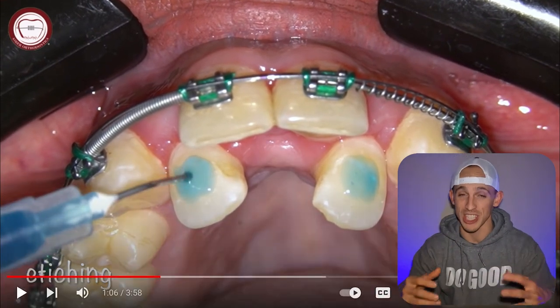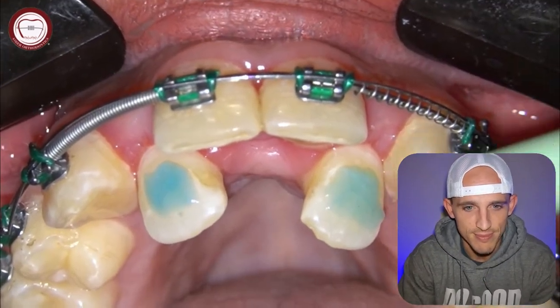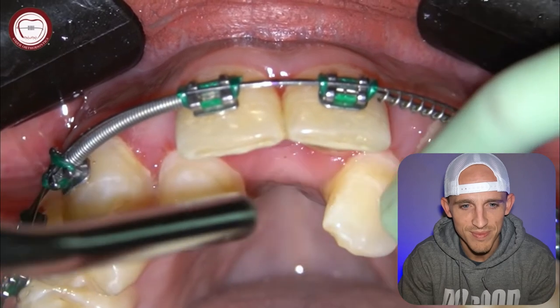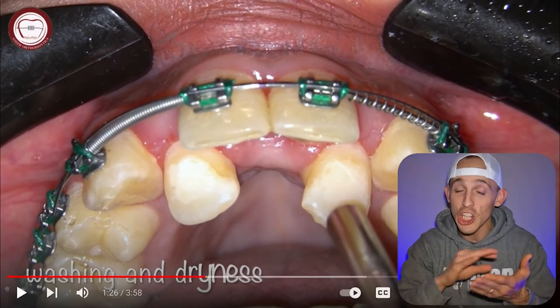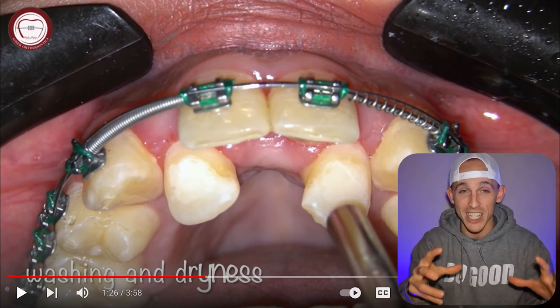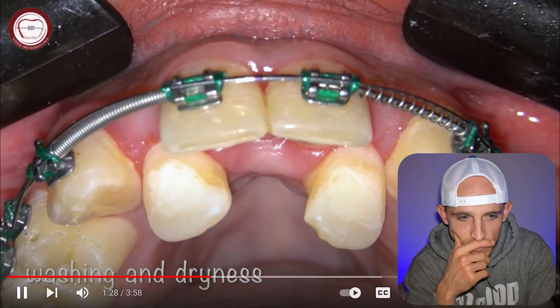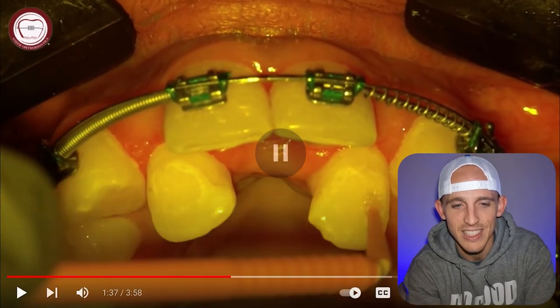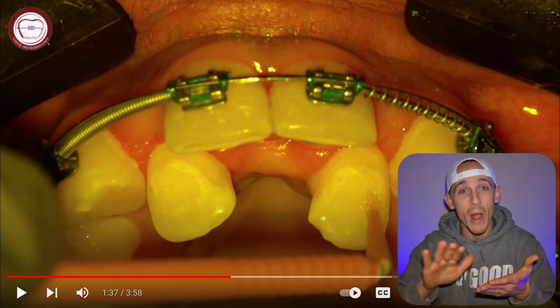This is the blue etching material — it's part of the cleaning process. You've got to clean the teeth and get them ready for the glue. They're probably going to glue something here. This is a great picture of what the teeth should look like after you've cleaned them off — teeth are white, and when you do this etching process it's like cleaning it off more, so you get a white patch. That's what it looks like for an orthodontist or dentist gluing something — a filling or bonding a bracket. Now they're putting on a little primer, which is just part of the glue. When people say their teeth look yellow, sometimes this primer contributes to the yellowness — don't worry, it goes away once they remove all the brackets.